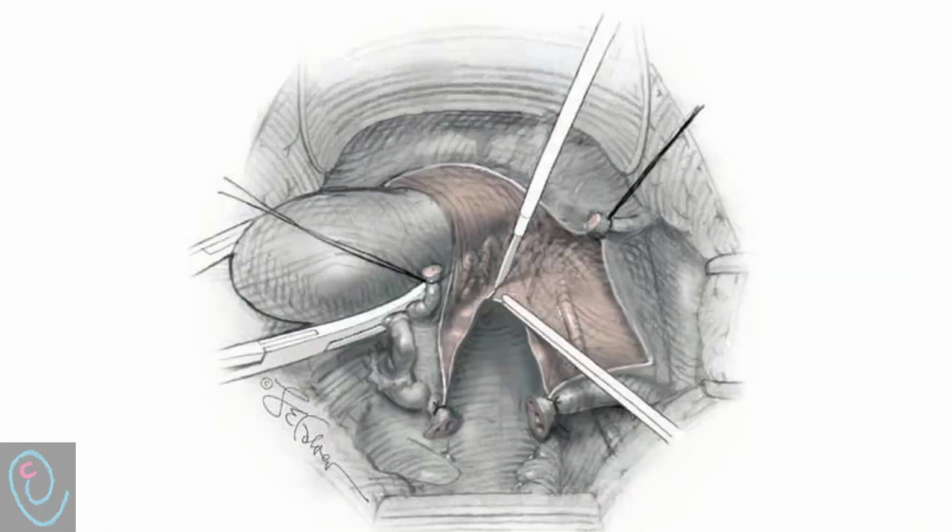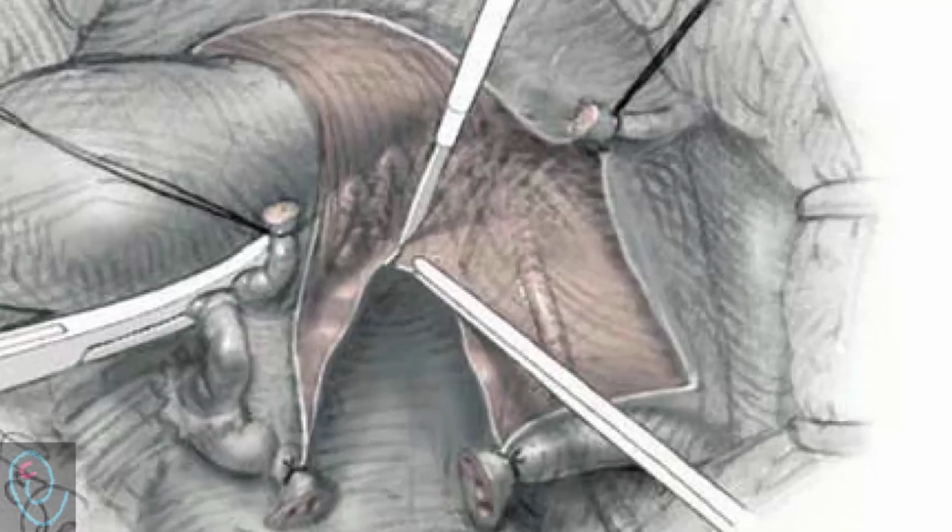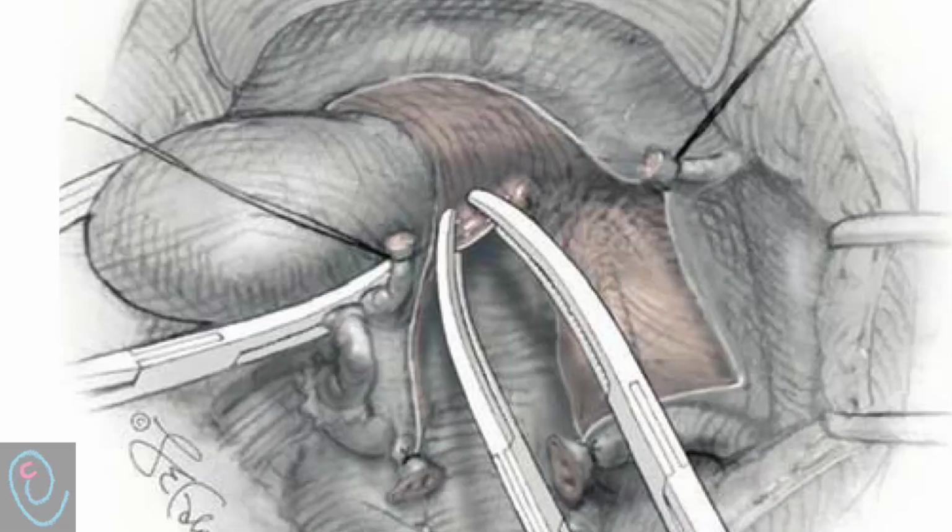Step number 11. Uterine arteries. The uterine vessels are identified laterally along the uterus. Some peritoneum and loose areolar tissue still surround these vessels. Incising and removing such tissue from around the vessel is termed skeletonization. After skeletonization, the uterine vessels are secured by a curved Heaney clamp at the level of the uterine isthmus.